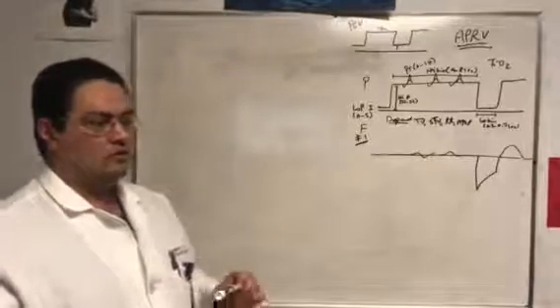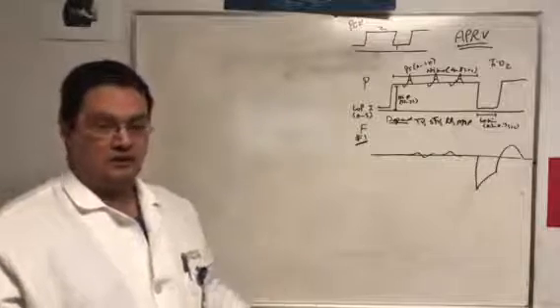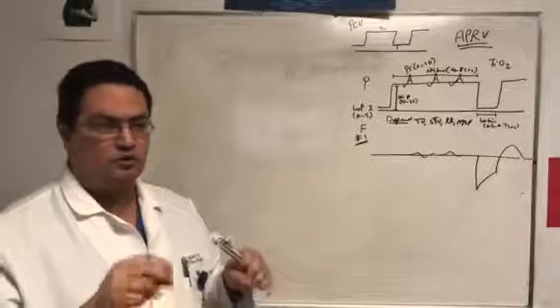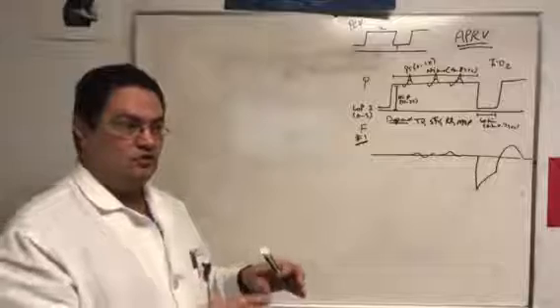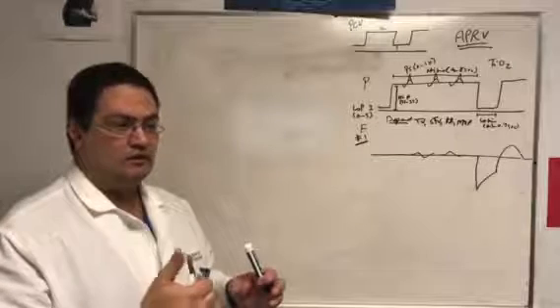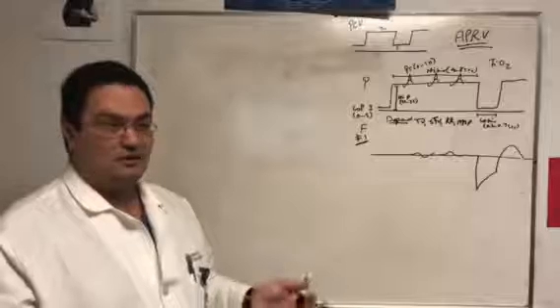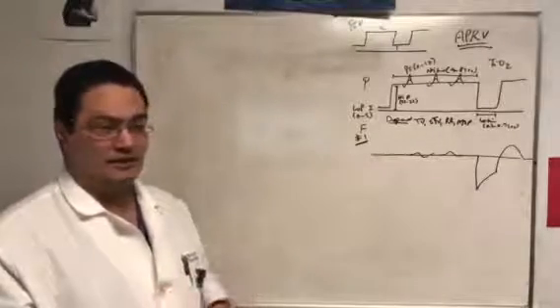So that's another claim to fame of this mode: it debunked the belief that auto PEEP is inherently bad. You can actually use the auto PEEP to your advantage, which this mode is doing, but regulating it. It's like playing with fire in the circus: either people are gonna clap for you or you burn yourself. That's exactly the analogy here, right?